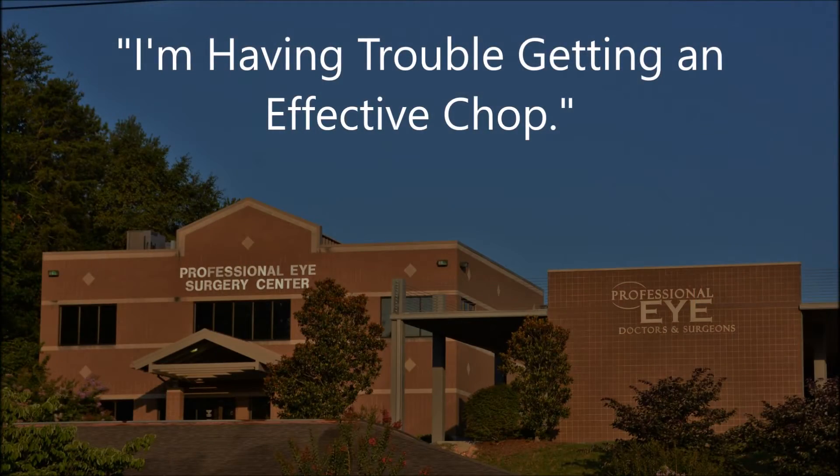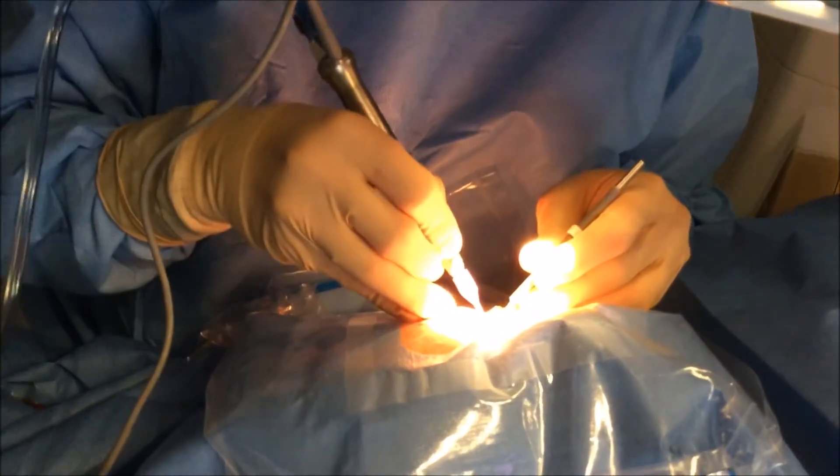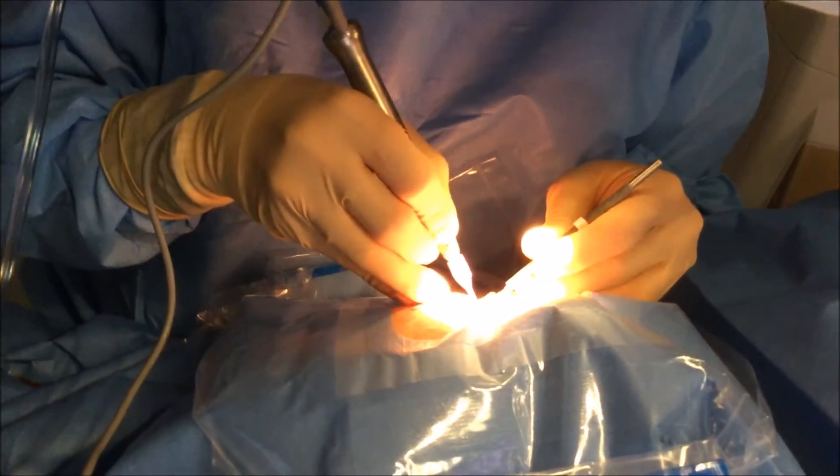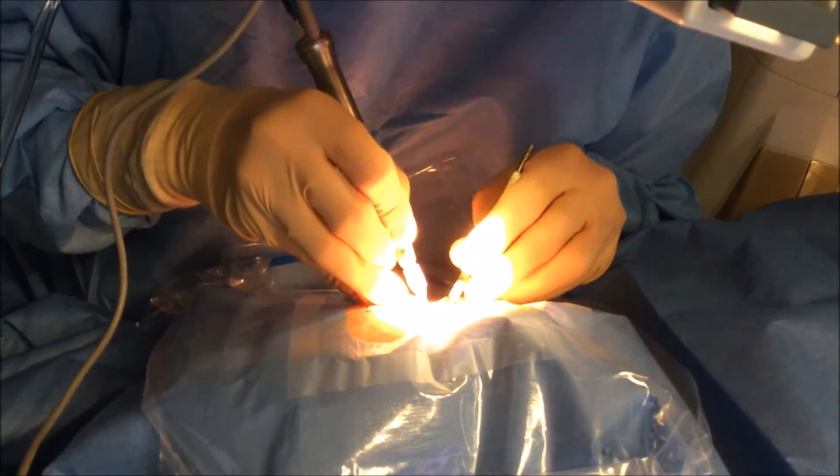The other issue is some people are having trouble obtaining an effective chop. First of all, you have to be comfortable with performing horizontal chop — getting that chopper out to the equator and underneath the anterior capsular rhexis opening and getting it in proper position is very important for this technique. If you're not comfortable with that, that's the very first step. The next issue is you have to place your hands in a very different position from traditional chop — it's in a more vertical position. The chopper is out to the equator and now the facotip is placed in position.